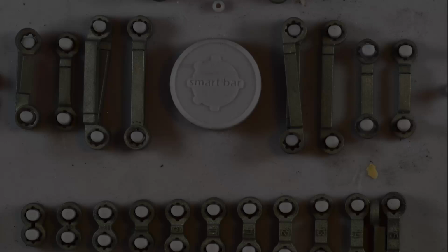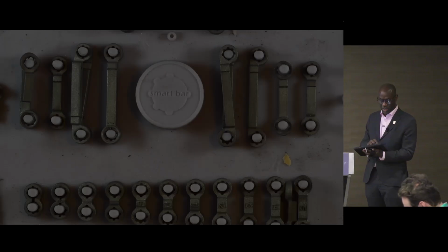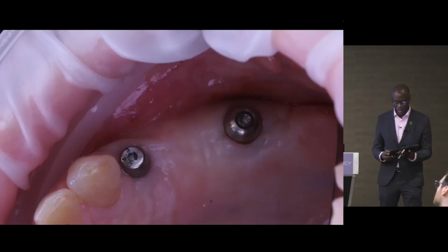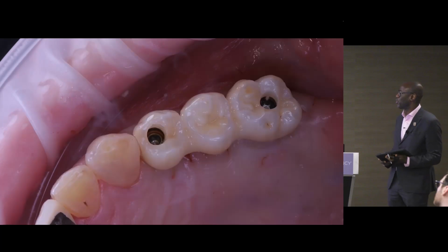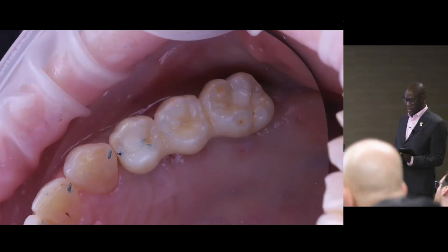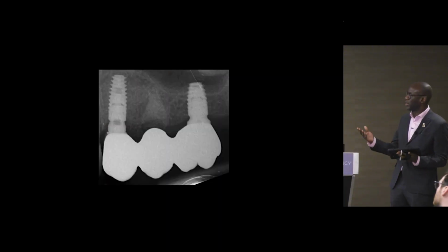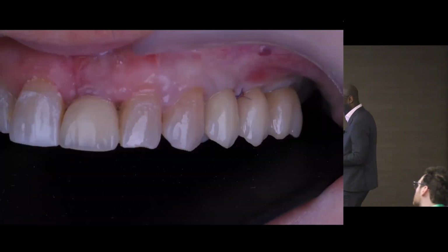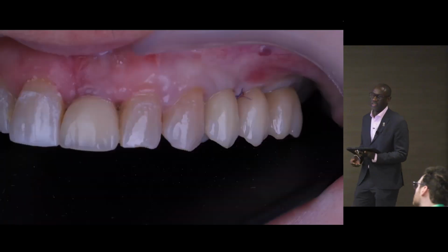So in this particular case that we've talked about, Steve has gone through that. He's made sure that we bond it correctly and put everything in the right place. We've been able just to finish that off by, again, just going through this process and procedure, placing that, and we can see there again the components in place, we can see the implants in place, and we can see how everything fits together.